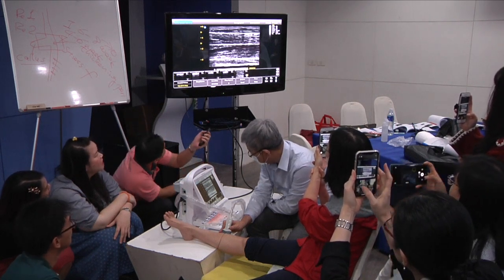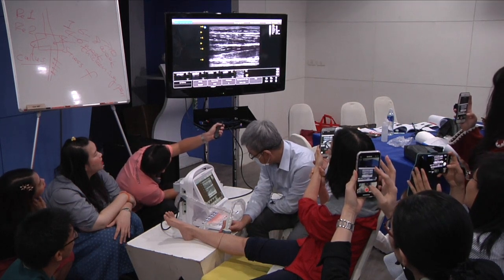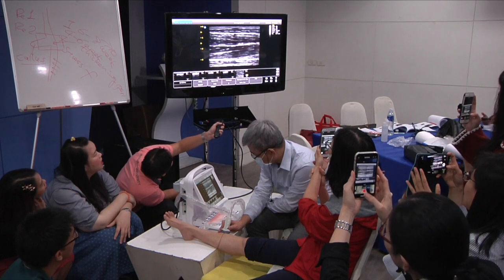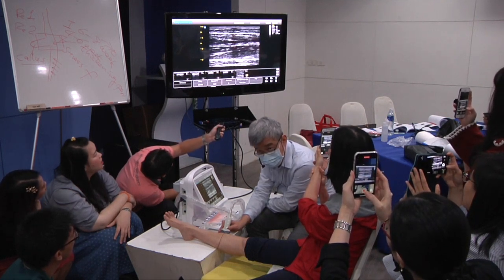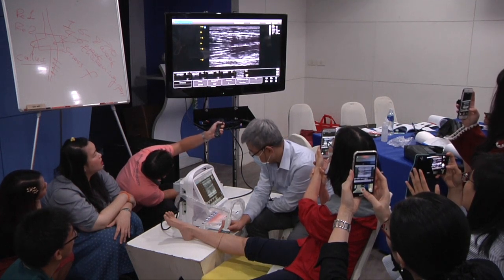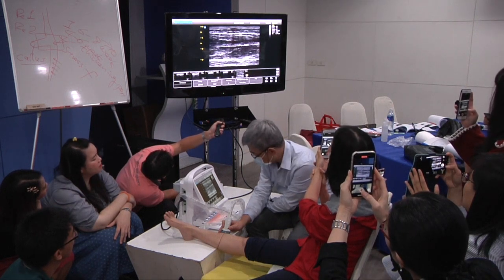Yeah, the shadow produced by the rubber band can be seen in the window, center of the window, right? There's a dark line, right? It's created by rubber band. Okay. It's very clear, right?